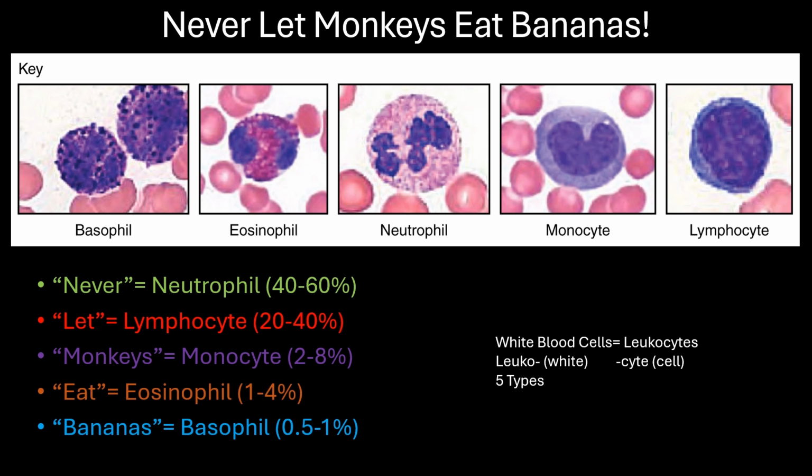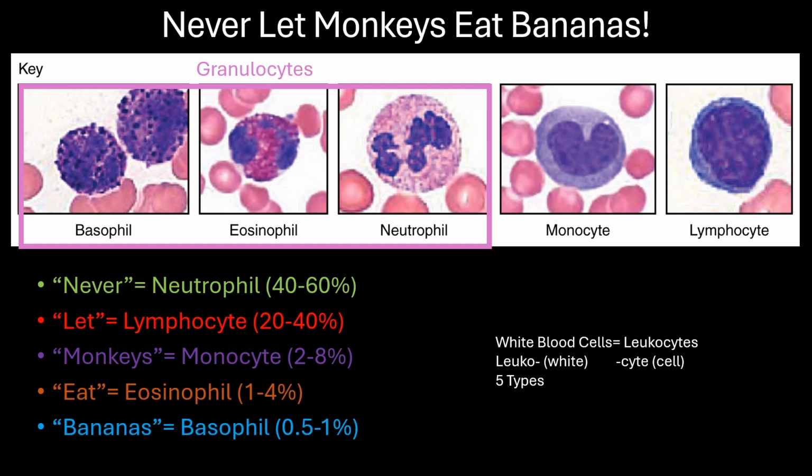Basophils. These are rare and relatively hard to distinguish between lymphocytes due to their dark staining appearance. So these are the 5 types of leukocytes in the order of how common they are. Depending on the source, the relative percentages might be a little bit different, but they can be fairly subdivided based on their appearance, such as being granulocytes or being agranulocytes.